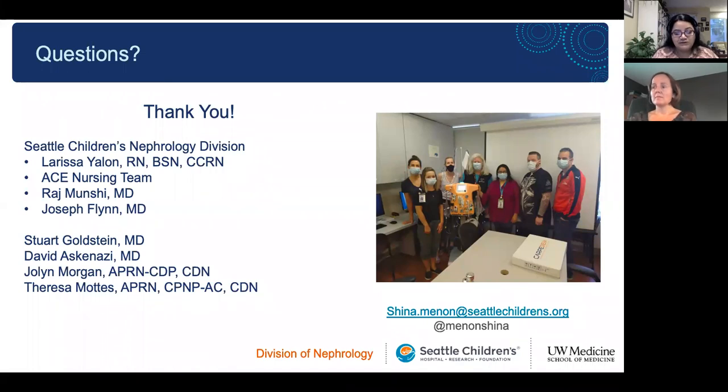The only situation where we found Aquadex was not very helpful, or would not be very helpful, is somebody who requires renal replacement for hyperammonemia. I didn't show that slide here, but as you know, for hyperammonemia we are trying to provide the same clearance as a hemodialysis session with CRRT, and our clearance can go as high as 8,000 mLs per 1.73 meters square per hour.